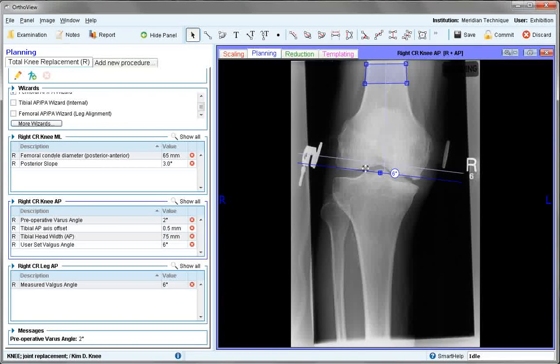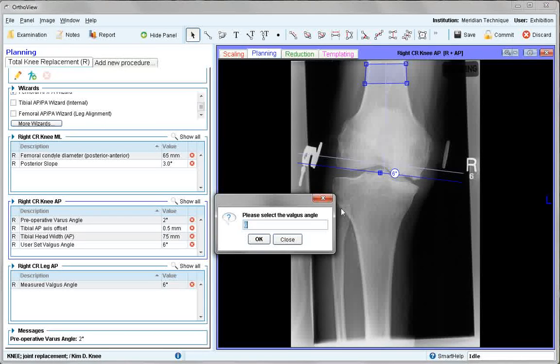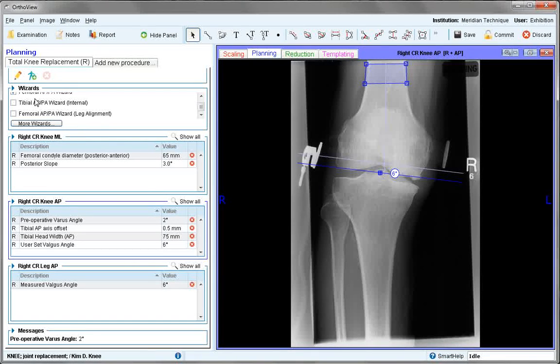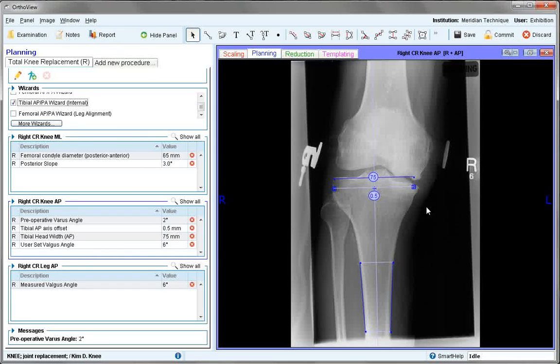The valgus angle can be set in preferences or adjusted here if a different value is required. There are two tibial AP wizards. We are currently using the internal, which is best to position if you only have a knee joint image. There is also an external wizard, which we will show after templating, as an alternative if you have a long leg image available.